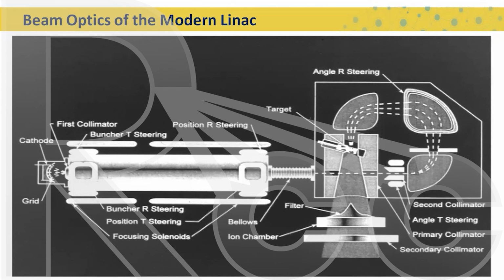We've improved a lot with our immobilization techniques. We've improved so much that patients are pretty much locked down pretty tightly now, especially with the masks that we use for head and neck cancer. The masks extend all the way down to the shoulders and lock everything down to the table. So with patient movement from Cobalt to a Linac, unless you have really good immobilization, the long treatment times mean that your immobilization has to be better.